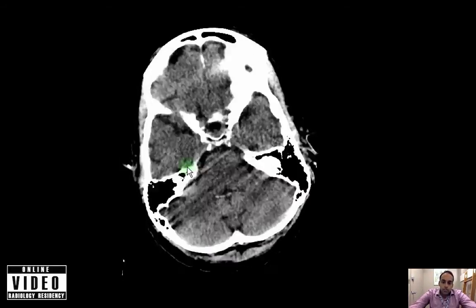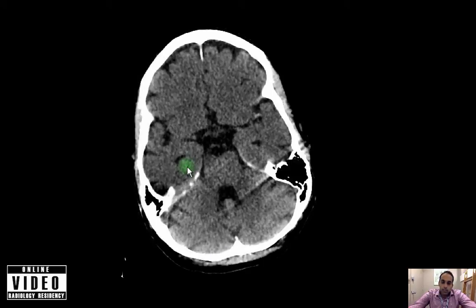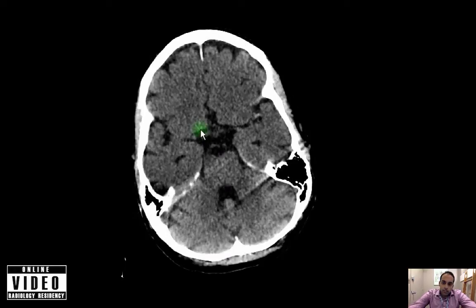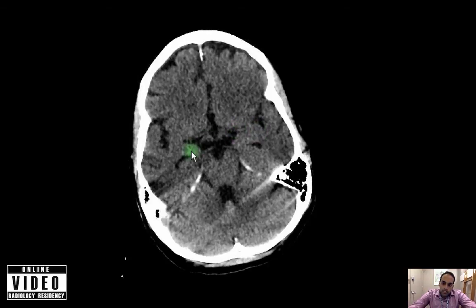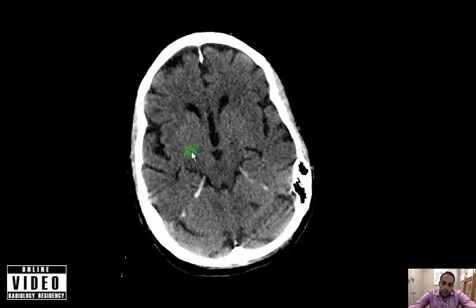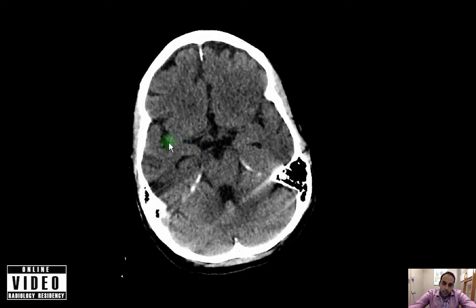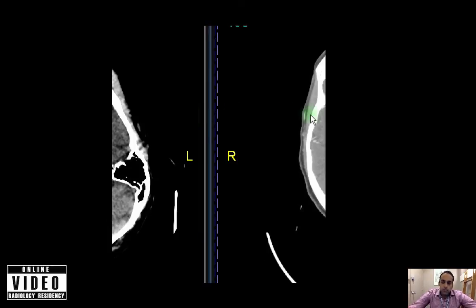Here's another patient with acute onset of right-sided weakness. Again looking all over but focusing on the left, I came down to the supracellar cistern to look at her vessels. Following out the MCAs, I noticed on the left that right at the bifurcation it gets a little dense, while the rest of the vessel doesn't look as dense. Comparing to the right MCA, I'm not seeing as much density. This looked suspicious, so we called it and proceeded to a follow-up CT angiogram.